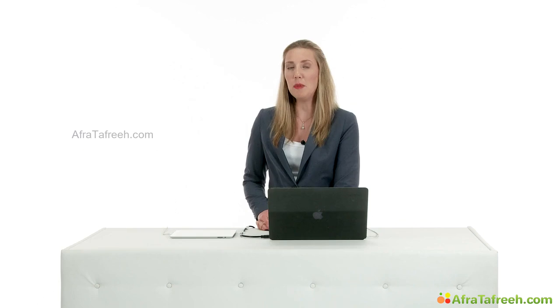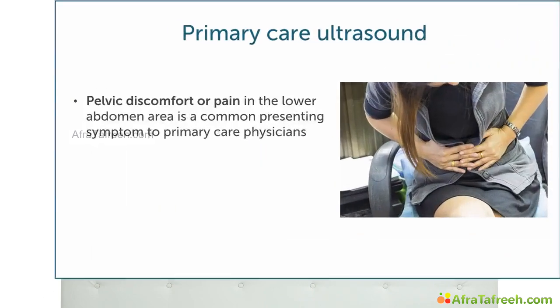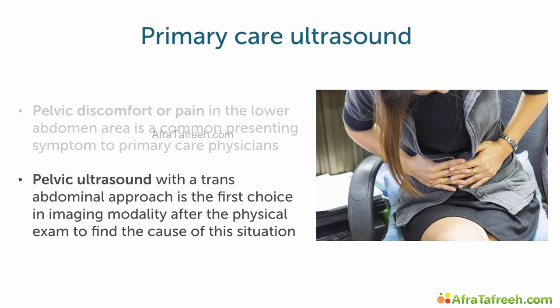In this lecture, we will talk about ultrasound in the female pelvic. We would like to give you an overview of ultrasound advantages which can be made in primary care, especially related to early pregnancy. Pelvic discomfort or pain in the lower abdomen area is a common presenting symptom to primary care physicians. Pelvic ultrasound with a transabdominal approach is the first choice in imaging modality after the physical exam to find the cause of this situation.